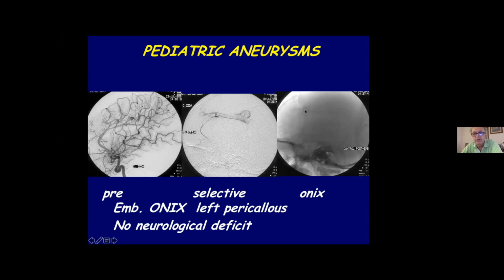And the glue totally occluded the aneurysm. This patient was treated about 2001 or 2002. Sorry, I used the Onyx, not the glue, Onyx. Finally, the patient doesn't have a major deficit, and total cure of both aneurysms.